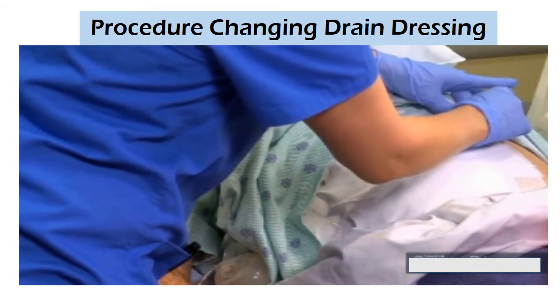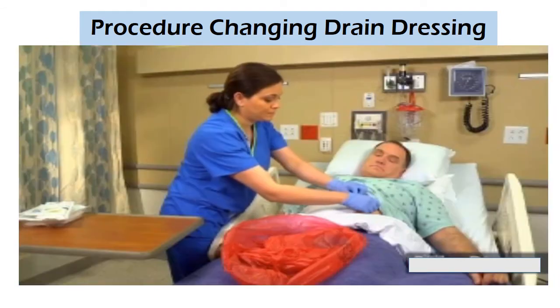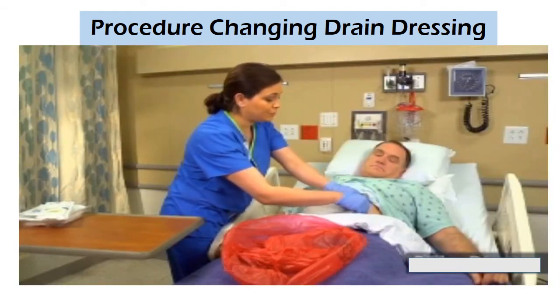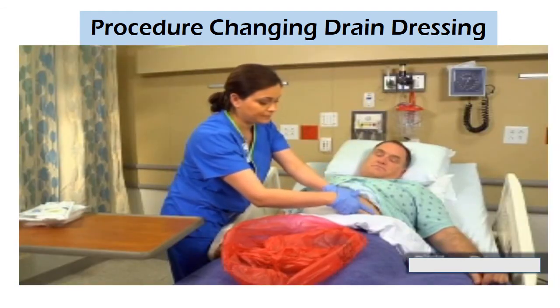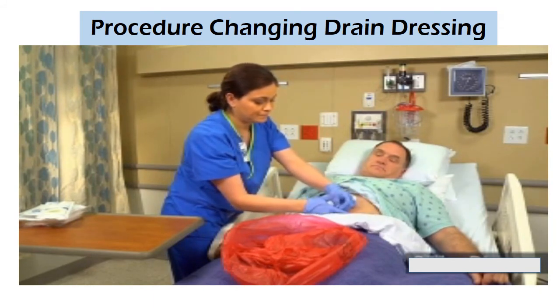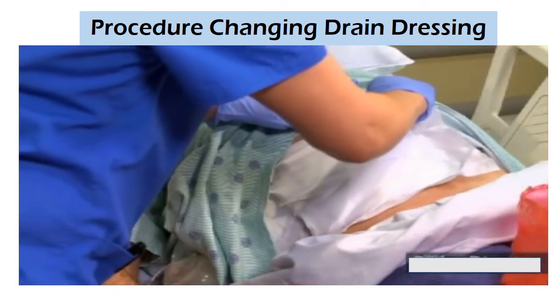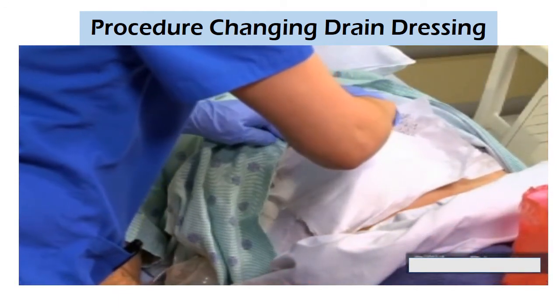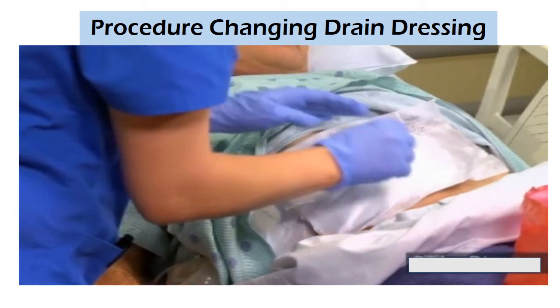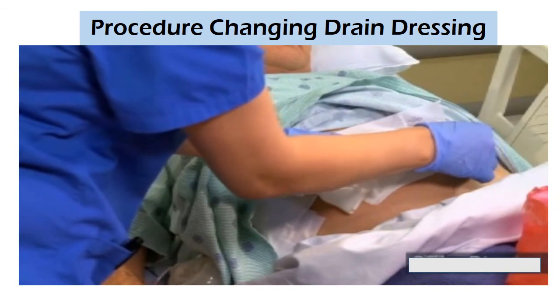Now you're ready to take off the old dressing. Remove the tape by pulling it parallel to the skin toward the dressing, holding down the uninjured skin. Be sure to pull in the direction of any hair growth. If necessary, obtain the patient's permission to clip or shave the area according to your agency's policy. Remove the old dressing 1 layer at a time with your clean gloved hand or with forceps. Observe the appearance of the drainage as you proceed.